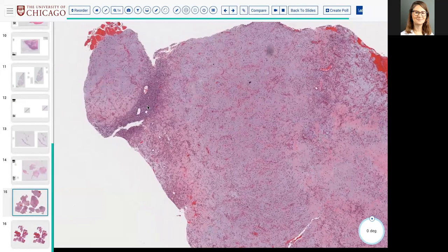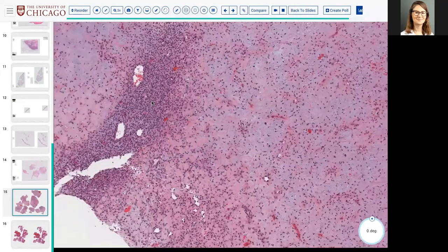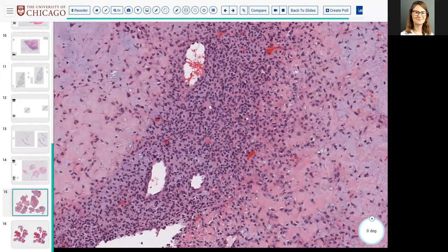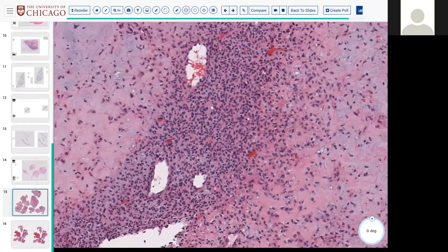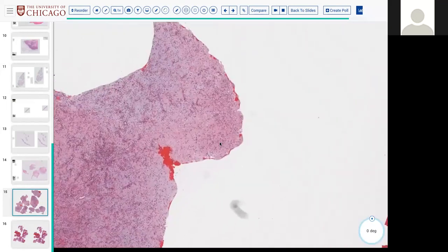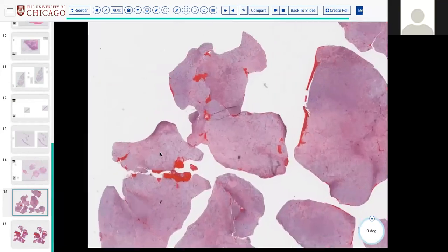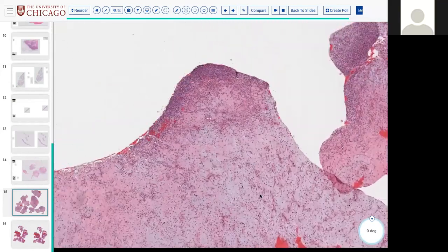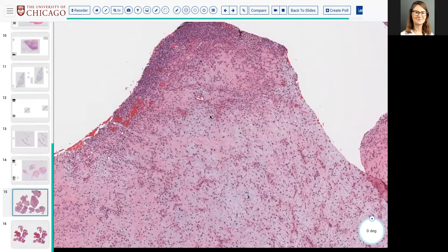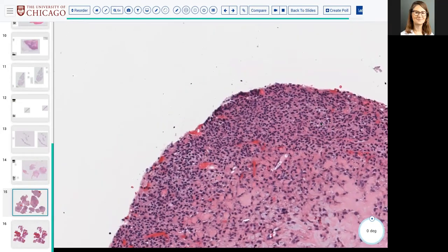All right. Anybody else have a guess? What about chondromyxoid fibroma? What about it? Tell me what you know about it. It's in young people. Yep. In the metaphysis. Mm-hmm. And it has myxoid cartilage, which this seems to have, with spindle cells and pink cytoplasm.